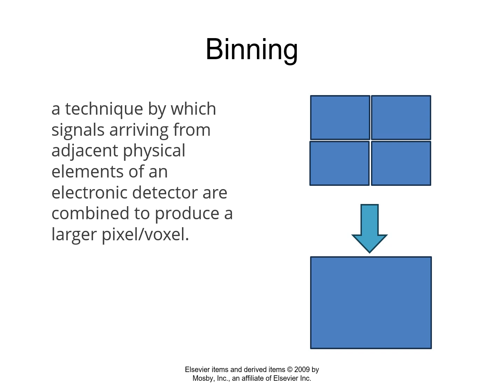All right, so the shortcut we can create with binning. Remember how we're trying to push at least 30 frames per second? Well, what the software can do is take the individual pixels that are adjacent on the image matrix, like 4 of them, and basically bundle all the charges together into one stack. Essentially, making those 4 smaller pixels into one big pixel, okay?